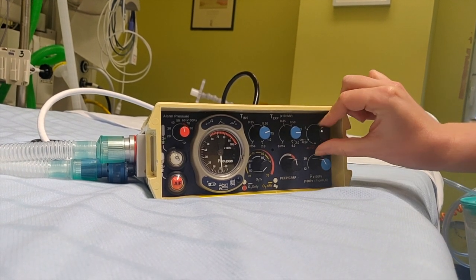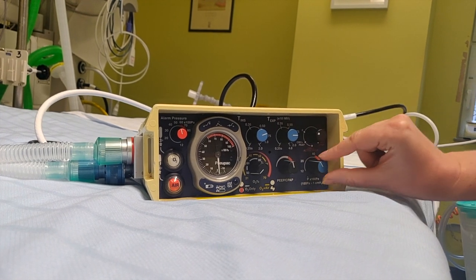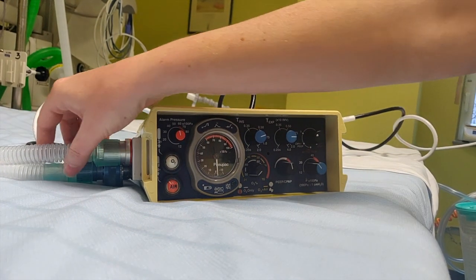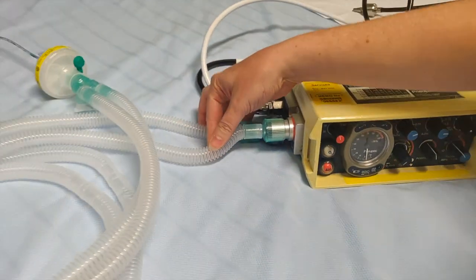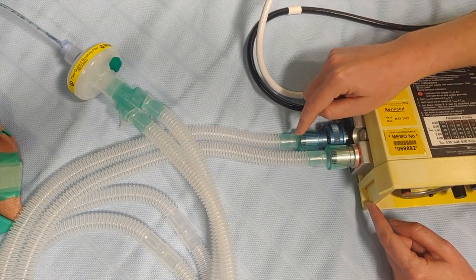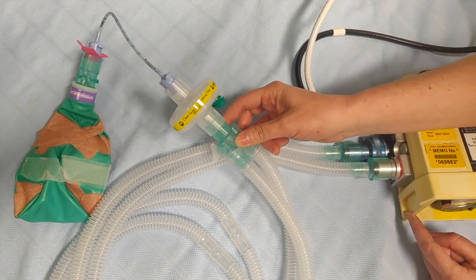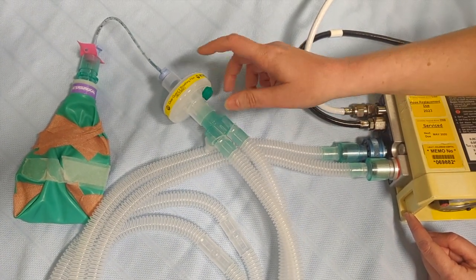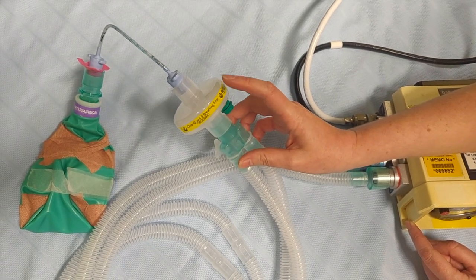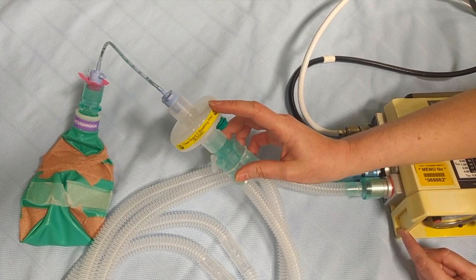So let's start. We have set this up. We're going to keep the PEEP mode and put the peak pressure on 25 and see what happens. We have this connected to a dual limb circuit. We haven't put a filter at the expiratory valve — we've put it at the Y-piece of the patient. Remember to have some sort of filter; in this case we've put a purely bacterial one, but you would use an HME with filter to keep some humidity for the patient.